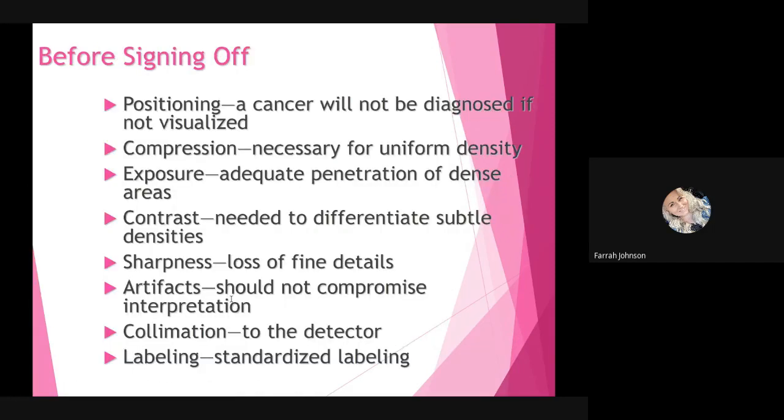So before signing off, the positioning: a cancer will not be diagnosed if it's not visualized. So that is why patient positioning is so, so important. Also, compression, it's necessary for uniform density.